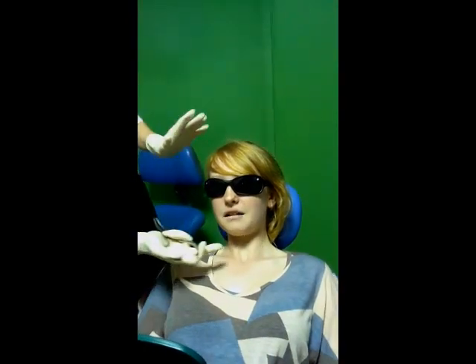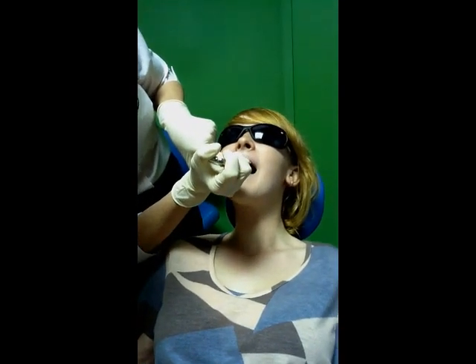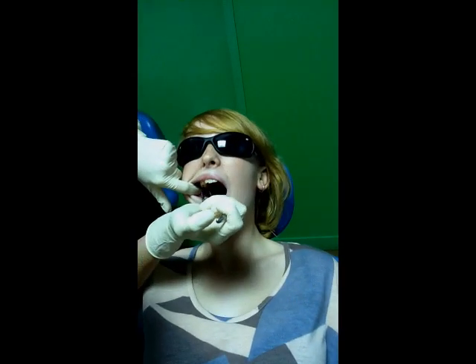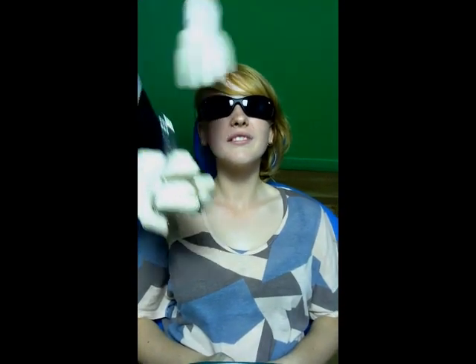Now I'm going to do the top ones. So what I want you to do is just look up to the ceiling for me. Fantastic. We've just got a couple more to go for the very back ones back there. Sometimes those are a little bit tricky to reach with these tweezers and we need to use a different method of putting them in, but we'll try with the tweezers first — we might be lucky. You're making this very easy for me today. They're going in nicely.